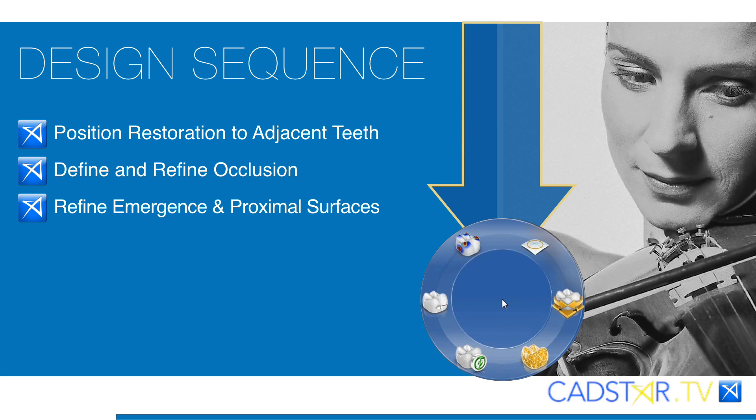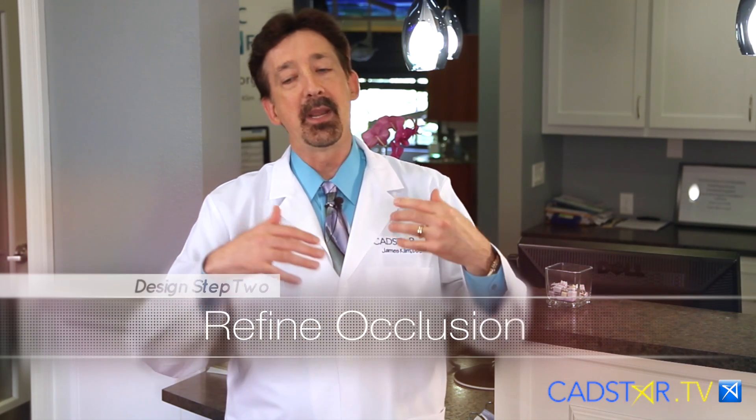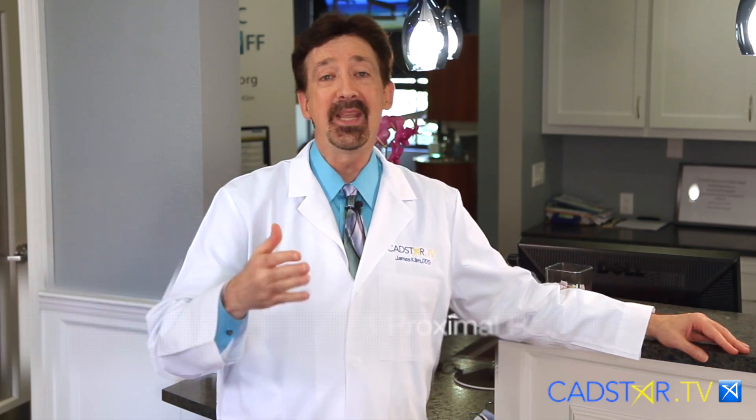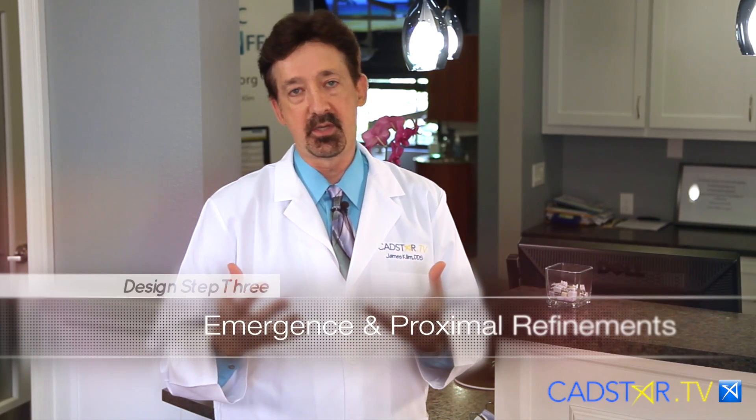Usually it's on. Number two is I look for occlusion. I want to make sure my occlusion is on, and we will go through that in other videos on occlusion. You've got to watch the video on how to avoid high occlusion — it will change your life. I wish I saw that before puberty; I would have had a better life on how to avoid high occlusion. However, occlusion is number two, and then number three is emergence and proximal contacts.